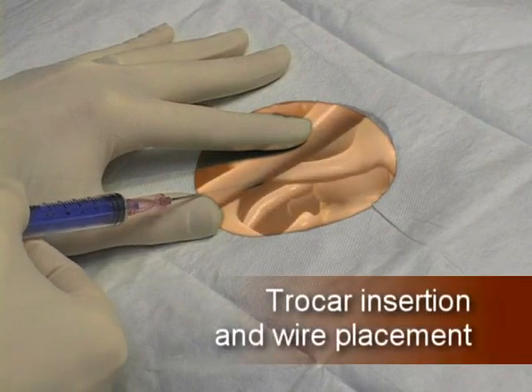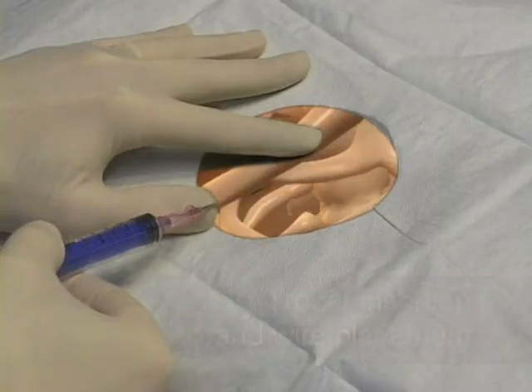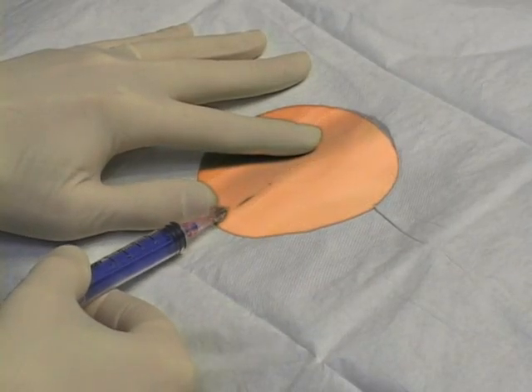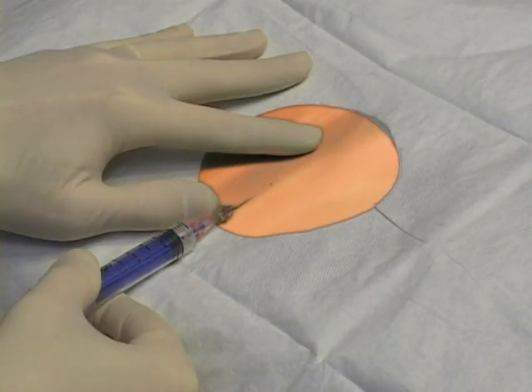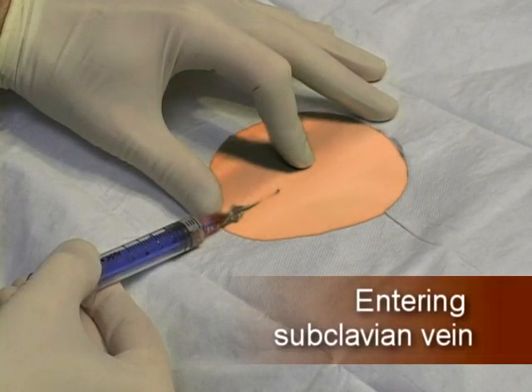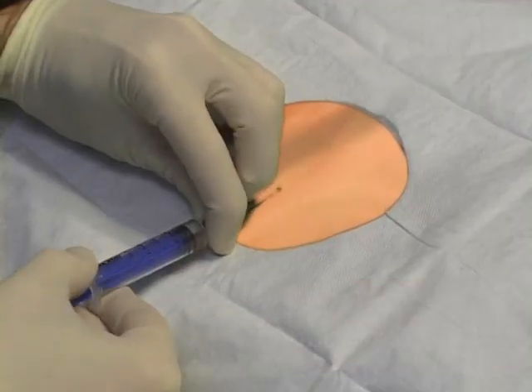Insert the introducer trocar at the midclavicular line and pass it under the clavicle, keeping its tip aimed toward the sternal notch. Retract the syringe plunger to create negative pressure so that when entering the subclavian vein, a flash is seen in the syringe.